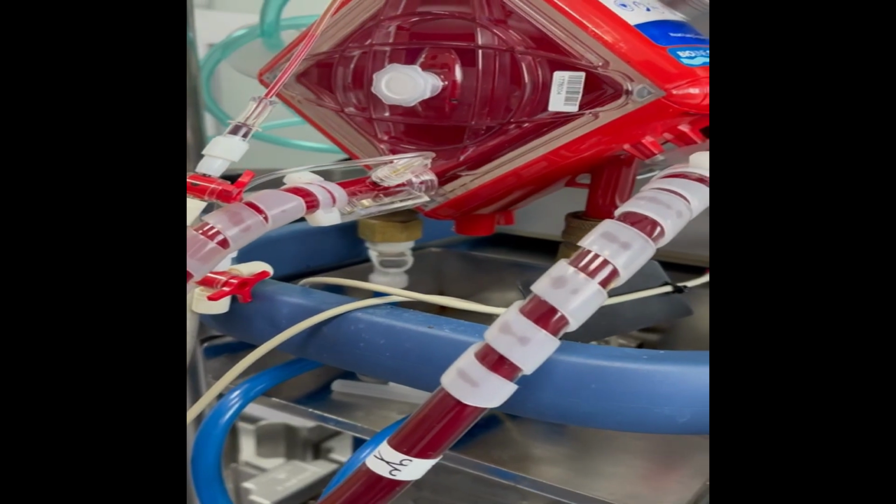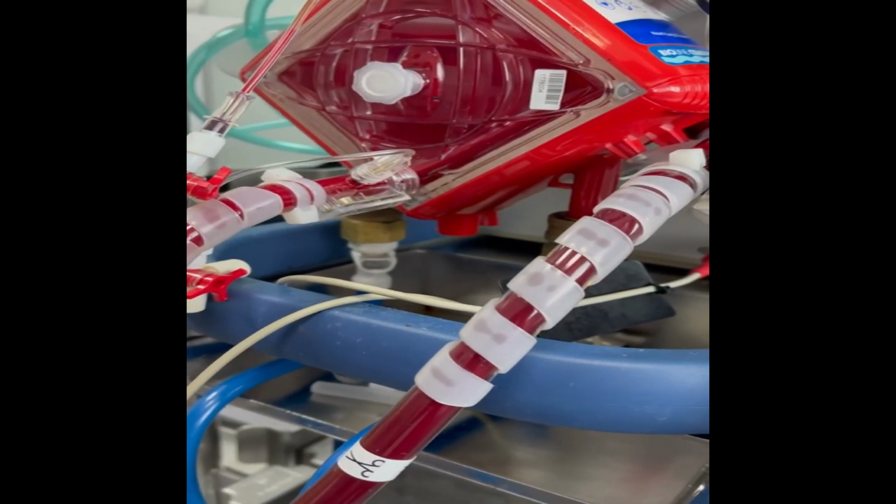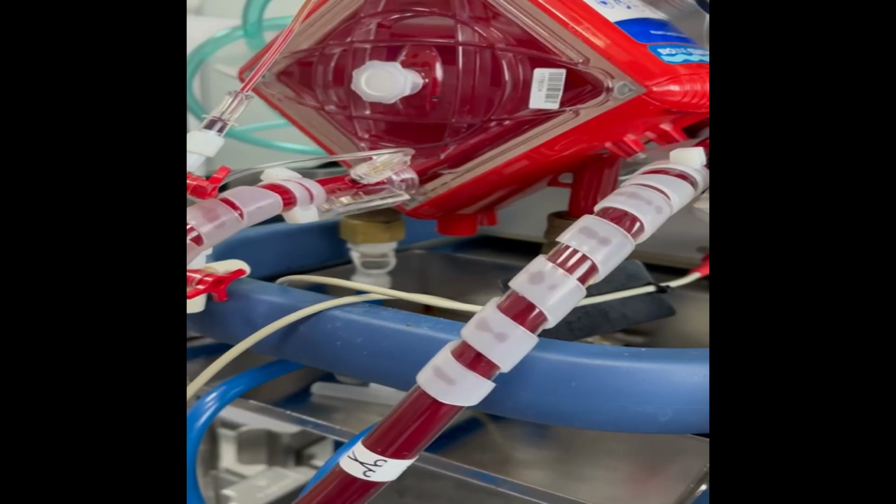If the patient has only hypercarbia and a low sweep gas, every 8 hours we should do oxygenator coughing or sneezing, whatever the name, and this is done in 10 seconds. We increase the sweep gas to 10 to 15 to wash out the condensed water from the membrane side.